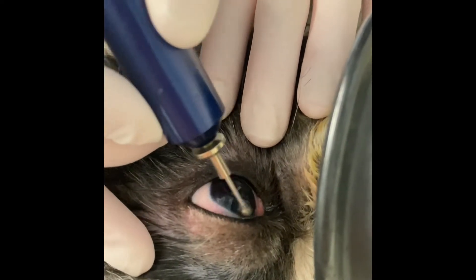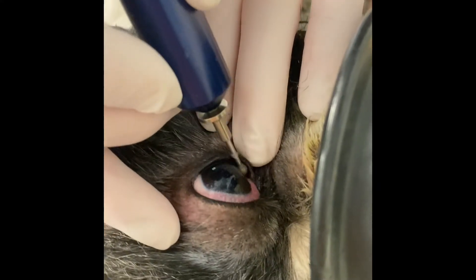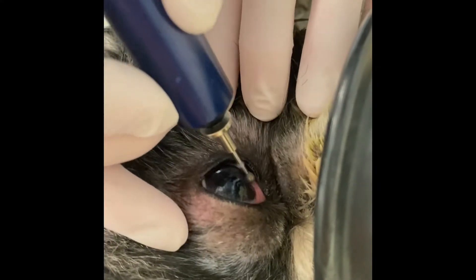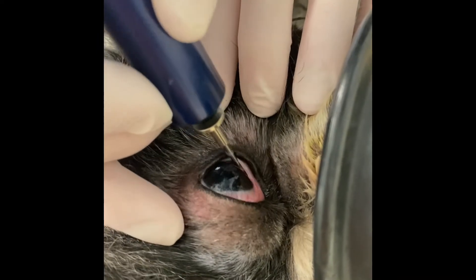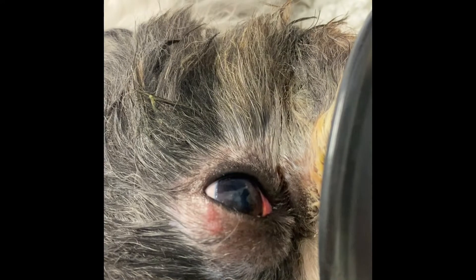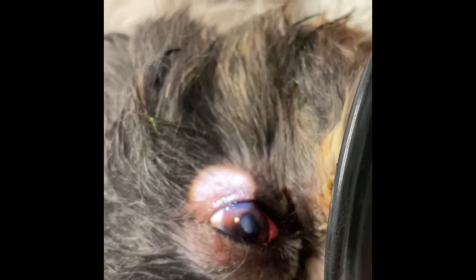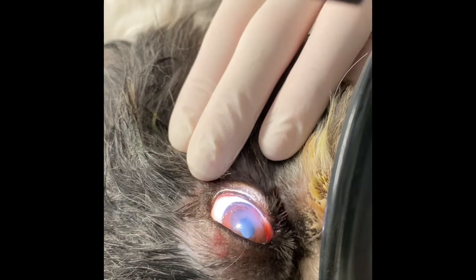With these ulcers, you'll find that they are superficial, tend to be irregular in outline, and will often have a halo effect where the epithelium is not sticking to the underneath stromal layer. Once you have identified these cases, then you can look at doing the diamond burr.